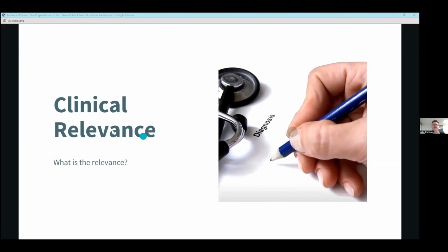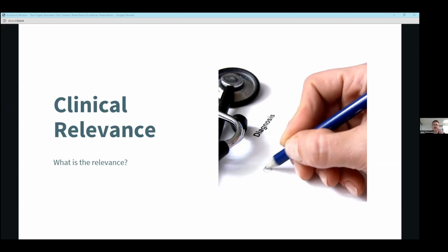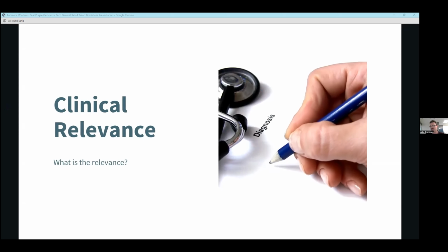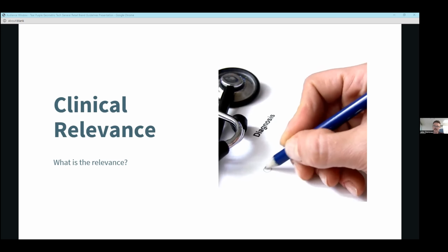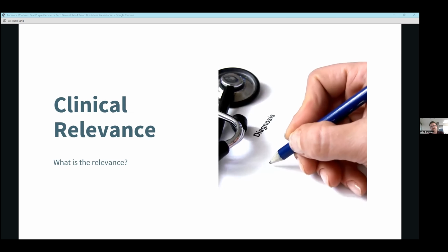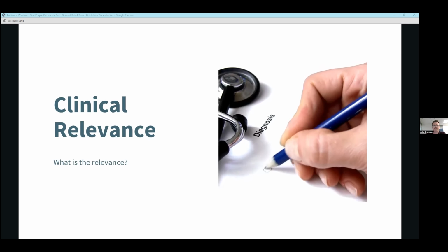So I've already kind of touched on this, but the literature really is a bit split on this. Whether some of it is more opinion-based and some of it is more science-based, I'm sure that there is that issue. But Lichtenstein and the work that he's done is very clear. He's validated his studies, and he's said small anterior consolidations indicates a C profile in his BLUE protocol, which indicates a pneumonia in 95% of cases in the study that he did, which is pretty significant.